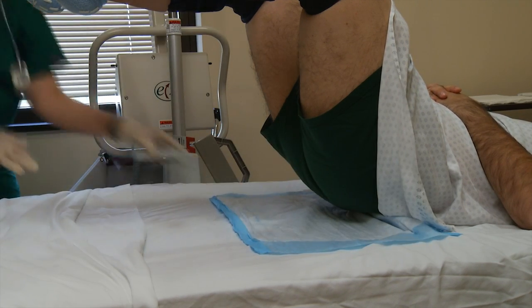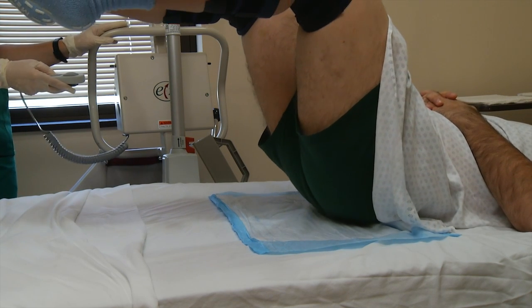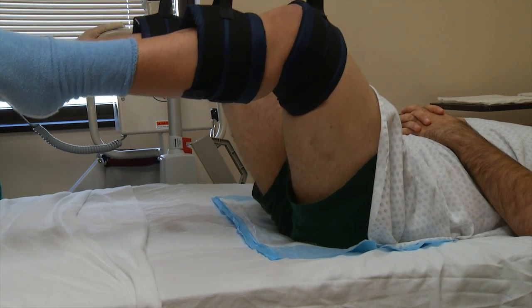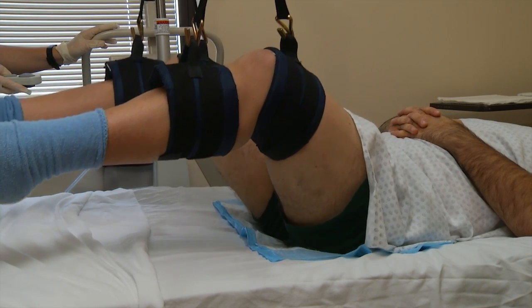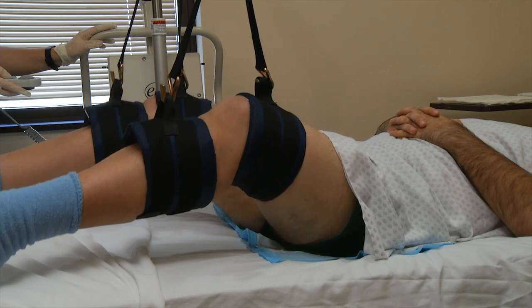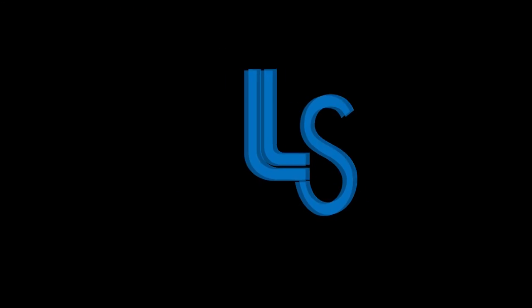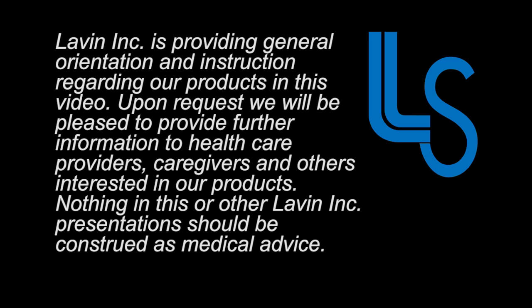The patient being suspended should not be kept up longer than required for the prescribed treatment. Laven LiftStraps should never be used for transport or restraint. Laven Incorporated is providing general orientation and instruction regarding our products in this video. Upon request, we will be pleased to provide further information to healthcare providers, caregivers, and others interested in our products. Nothing in this or other Laven Incorporated presentations should be construed as medical advice.